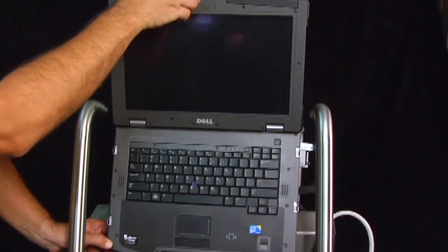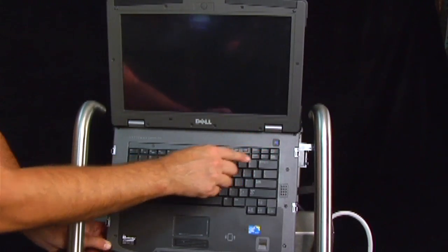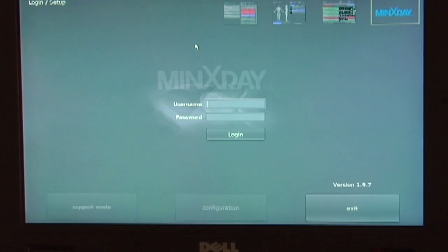Turn on the laptop computer and double-click the Min X-Ray icon on the desktop to activate DXR software. Log in with username and password. These will be set during installation.